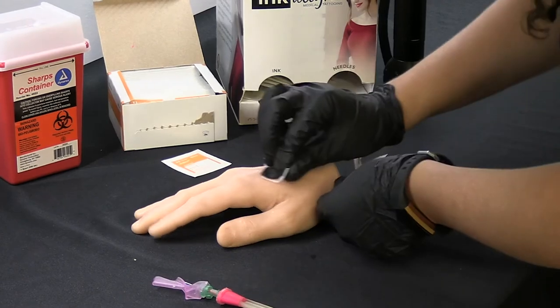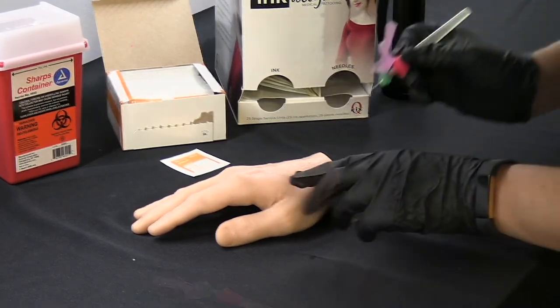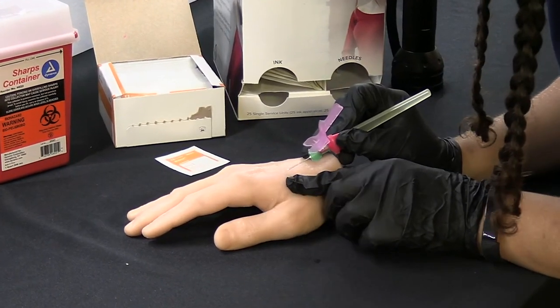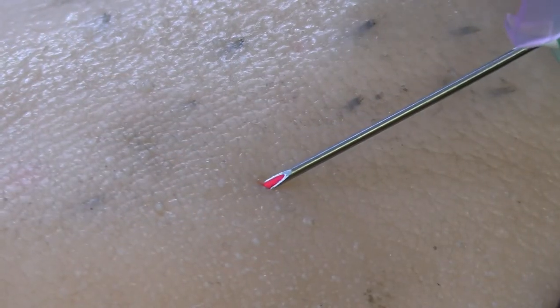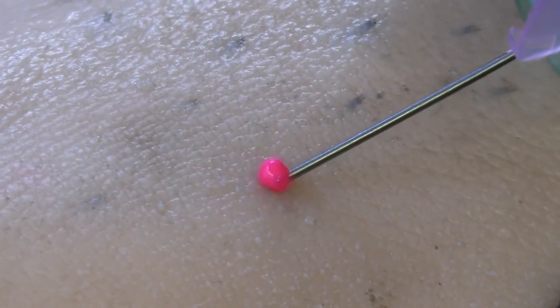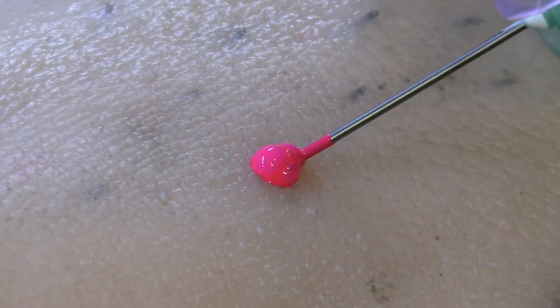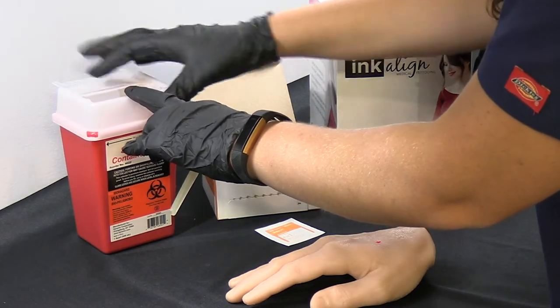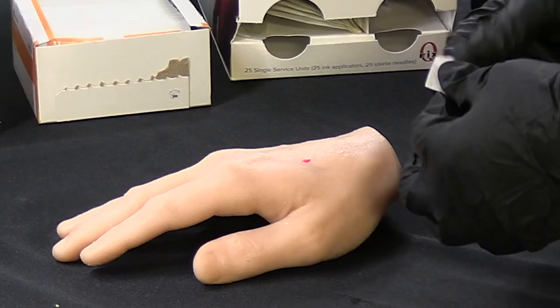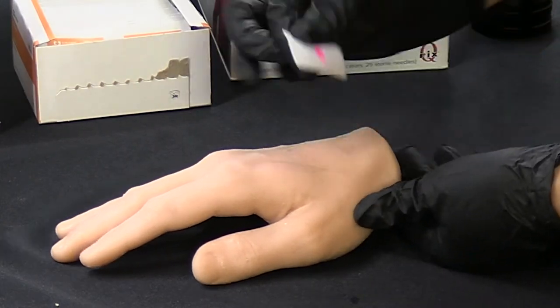Make sure the skin surface is clean and sterile. With your other hand, hold the patient's skin taut over the tattoo point. Gently insert the needle point under the skin's surface. Carefully squeeze the ink bulb. When you see the ink collect at the skin surface, remove the needle. Dispose of the needle in a sharps container and the ink can be discarded in the normal trash. Clean the excess ink off the surface of the patient's skin.